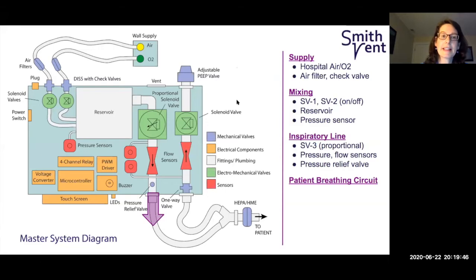The airflow then exits the ventilator and travels through the patient breathing circuit. On the way to the patient, it passes through a HEPA HME device that provides heat and moisture exchange going to the patient, and then filters the breath coming from the patient. This filter is especially important in COVID-19 cases to protect the healthcare workers from airborne coronavirus particles and prevent cross-contamination between patients. Having gone through the filter, the patient's expired breath then travels back to the ventilator.